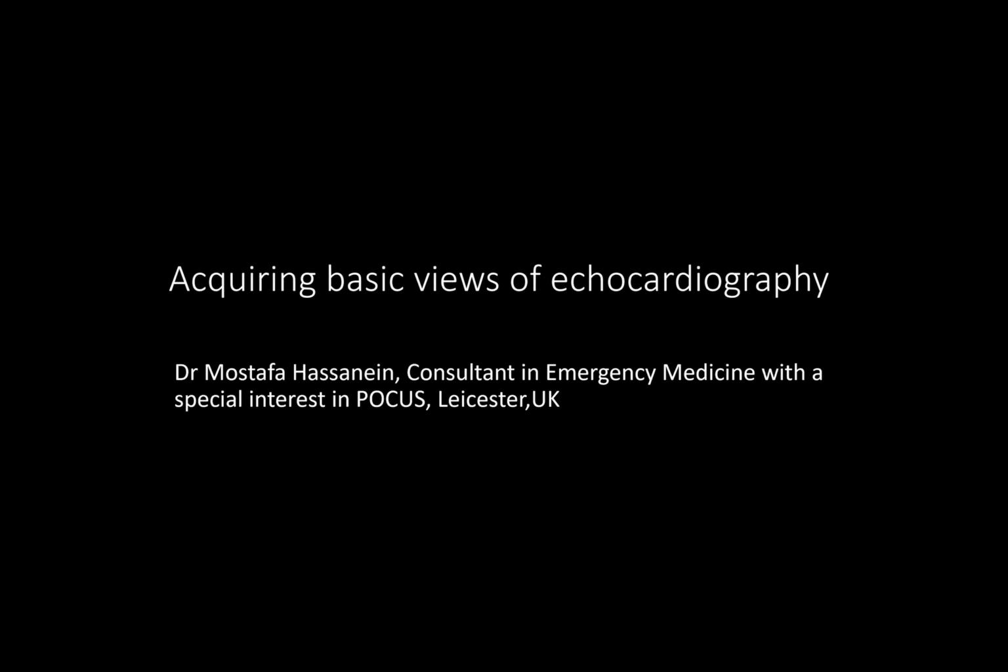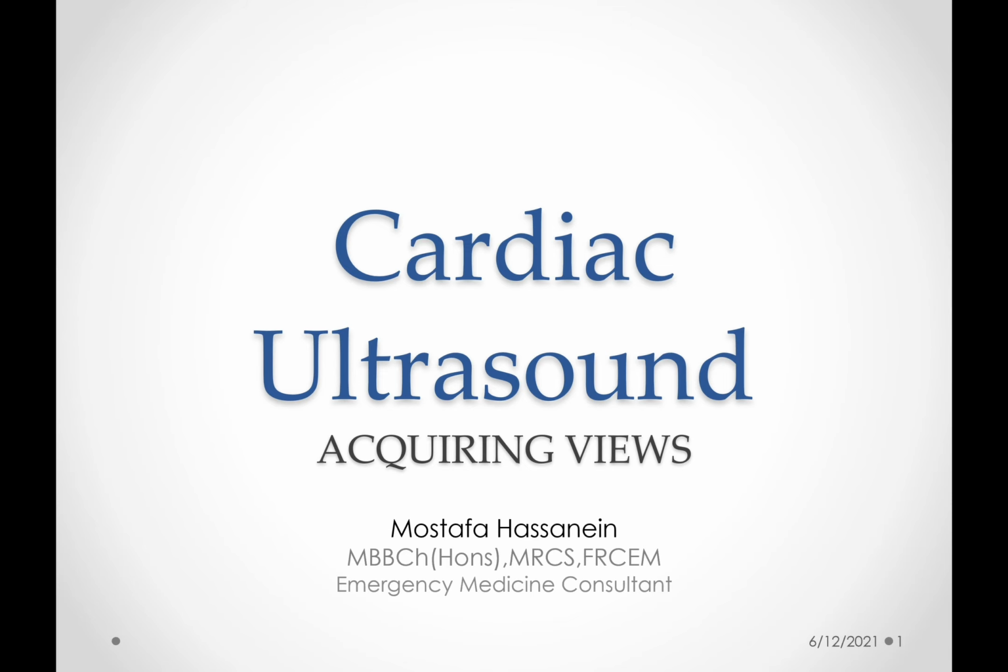Next topic: acquiring basic views of echocardiography by Dr. Mustafa Hassanin, consultant in emergency medicine with a special interest in POCUS from Leicester, UK. I'm an emergency medicine consultant with a special interest in POCUS. Today we'll talk about cardiac ultrasound, specifically acquiring basic cardiac views.